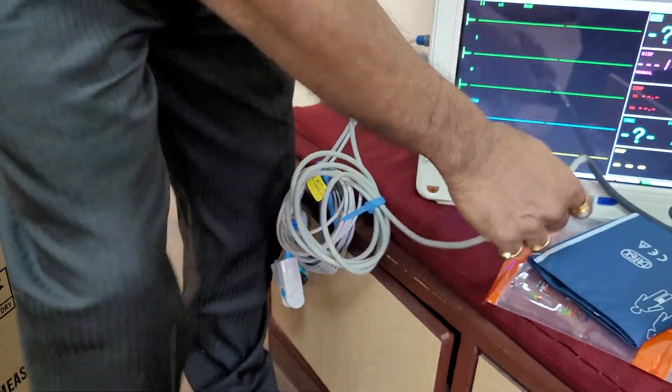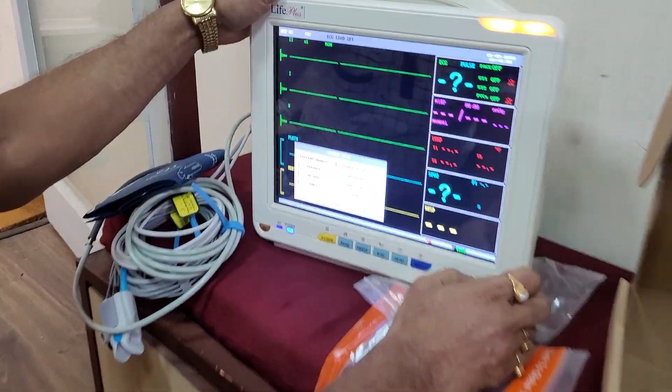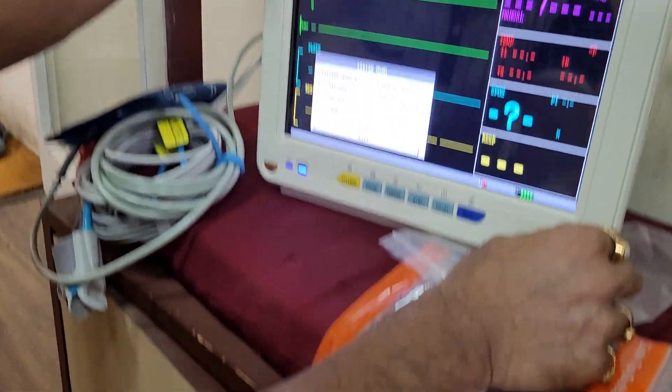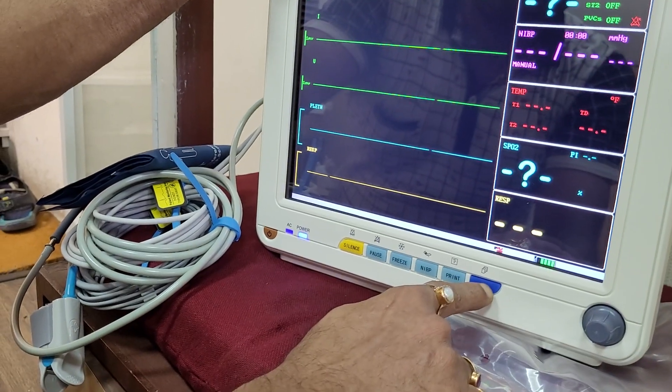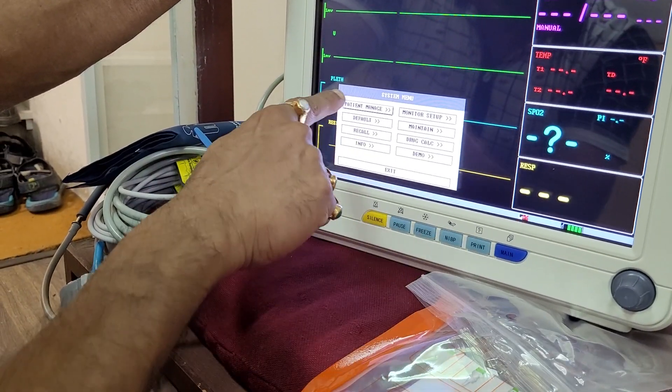Now for a demo, when everything starts, I can show you the demo station. First, you press — I can again show you the demo station. Just a gentle push on the main menu. When you press the main menu, one box opens.